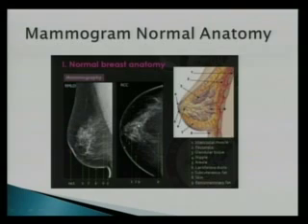But you'll have this area of tissue. And you can see here, maybe some of the tissue goes off of the edge, kind of tough to tell. But that technologist should have come in and done an exaggerated lateral view to include all of that tissue. Because sometimes cancers, upper outer quadrant's the most common area for breast cancer, and they can hide there. So if they don't include all that, you might be missing something. You can't just depend on one view to have seen it.